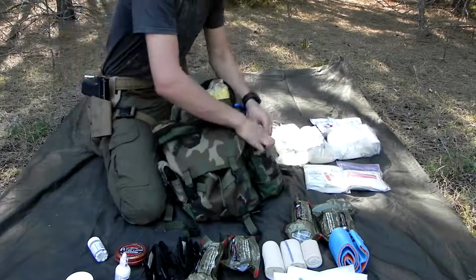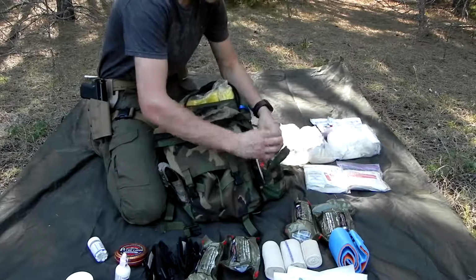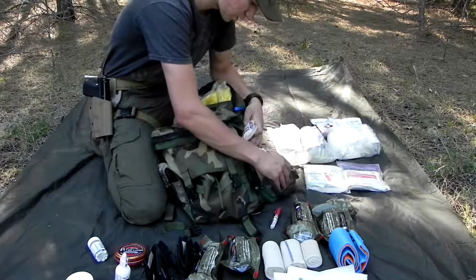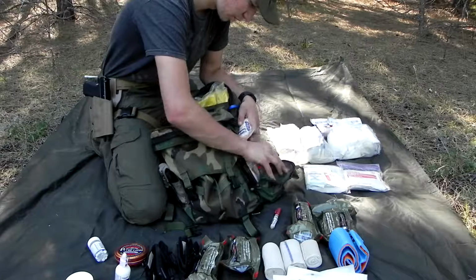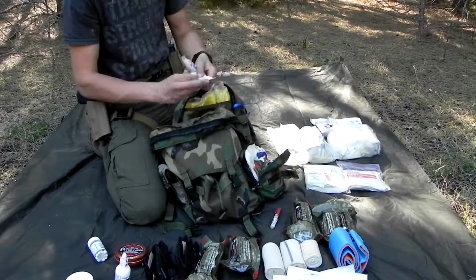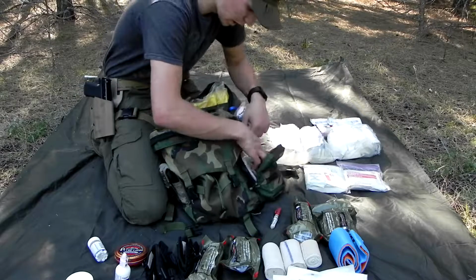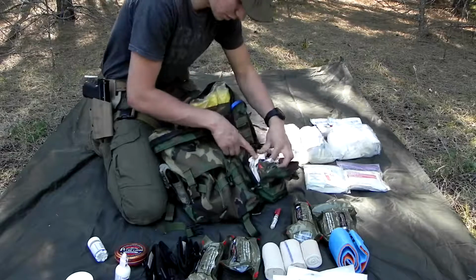And then this side compartment here basically has all of these items, but shrunk down into a smaller capacity so it's easy for me to grab stuff out of here. I have an ARS needle, triangular bandage, I have tape, another 4-inch trauma dressing, another elastic bandage, and another compressed gauze. And then I actually have hemostatic agent. I have some of the Celox. It's the granules. And then I have a nasopharyngeal airway and more gauze pads behind that.